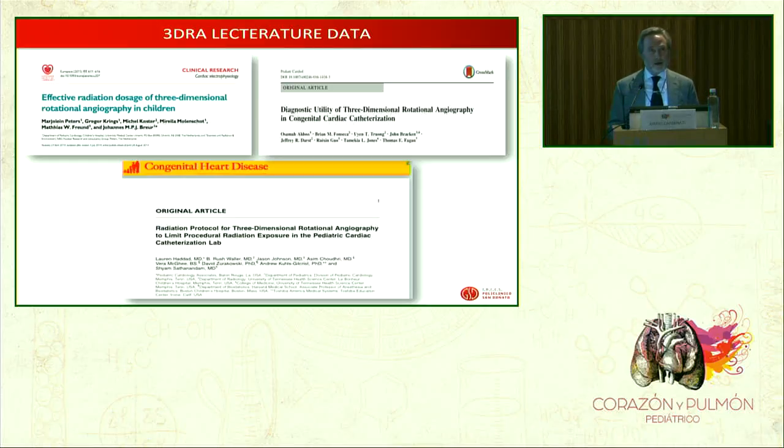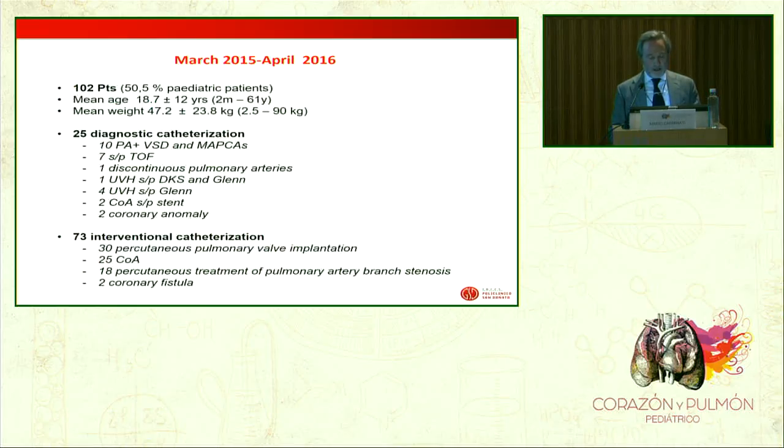And as far as the X-ray dose is concerned, you may argue that with prolonged injection we are giving more X-ray dose to the patient, but it has been demonstrated that there is no significant difference in X-ray dose between conventional biplane angiography and 3D rotational angiography.